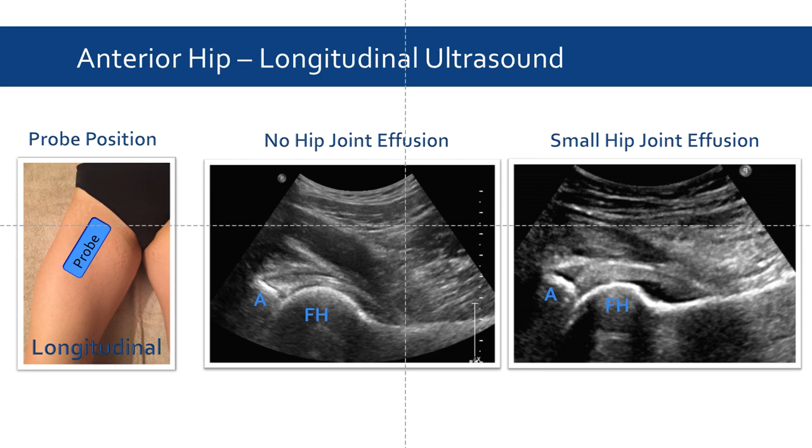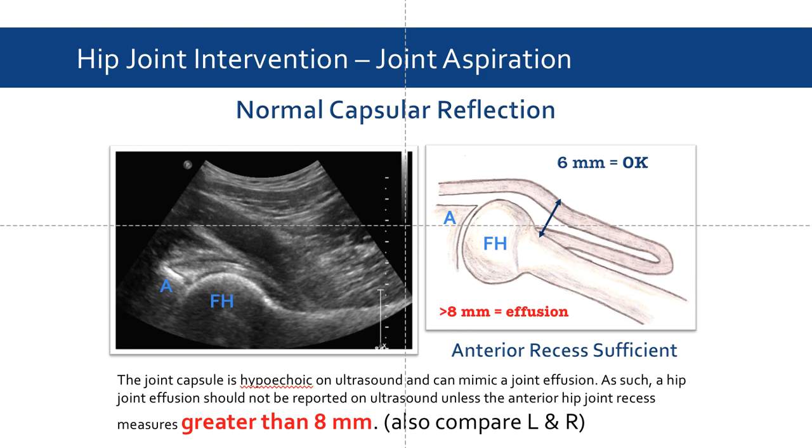Here we can appreciate the difference between a hip joint with no effusion and a hip joint with a small effusion. In the center panel, we see a normal anterior recess with minimal distension of the joint capsule. On the right panel, we see a small hip joint effusion where fluid has accumulated in the anterior recess, causing the joint capsule to distend. Notice that the effusion is hypoechoic. Before reporting a hip joint effusion on ultrasound, it should first be determined that the anterior hip joint recess measures greater than 8 millimeters, because the joint capsule is hypoechoic on ultrasound and can mimic a joint effusion.